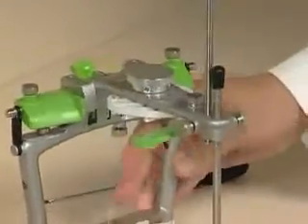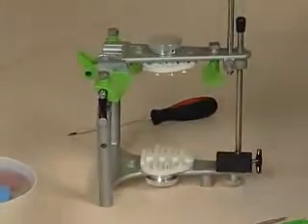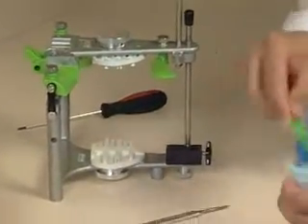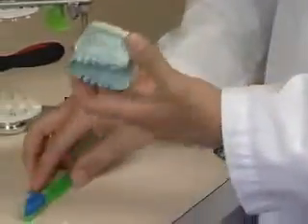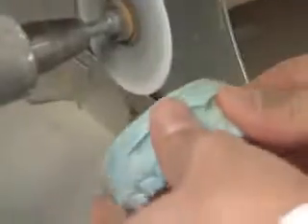Okay, now then, we want to check our models. We've already checked to make sure there are no bubbles and it's nice and clean. And we have to put some retention in the base of the upper and lower model. And also in the lower, you want to cut grooves in the lower also.